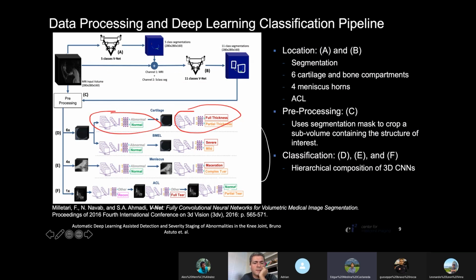These are classes, right? But these classes look a bit subjective. So you can have something that is full thickness and normal. So you can probably have a multi-label output. So it's a multi-level classification for one 3D object. You can probably have 3 labels. Is this possible or not?